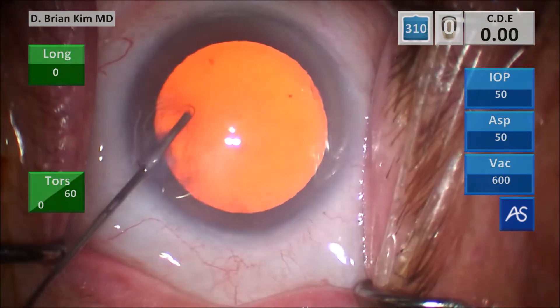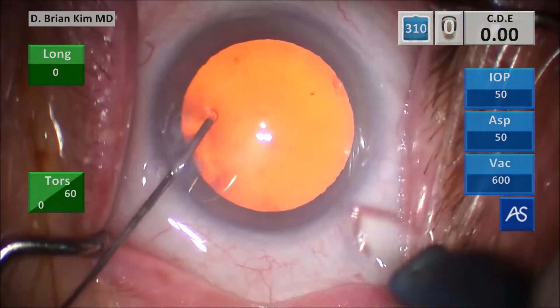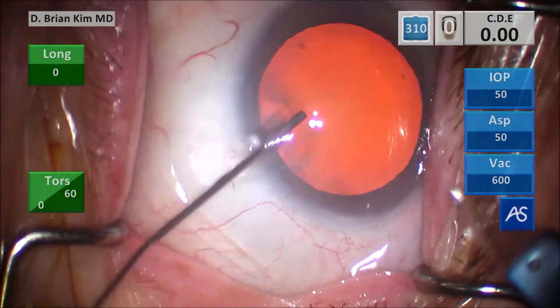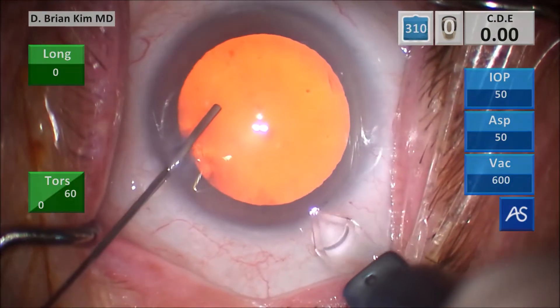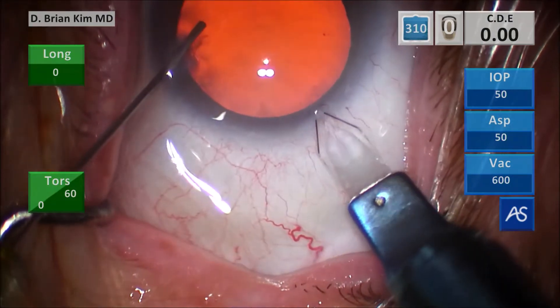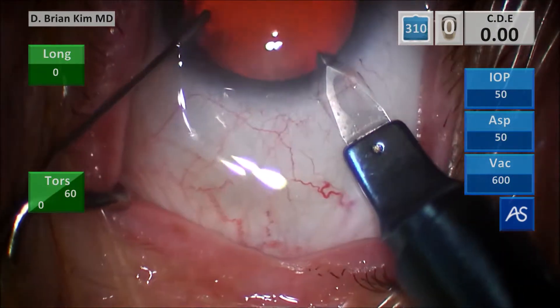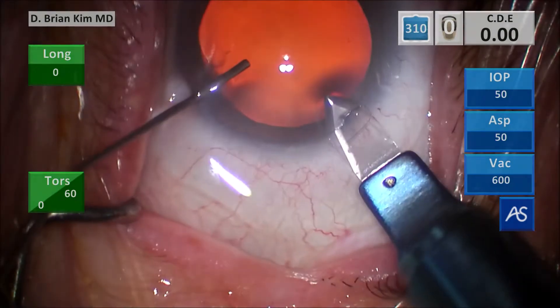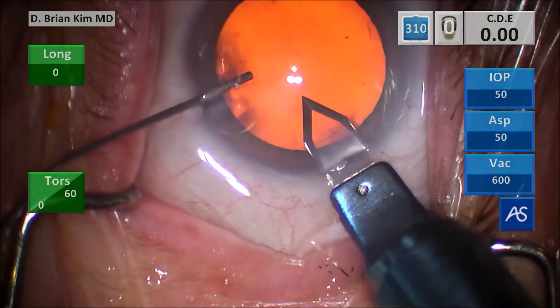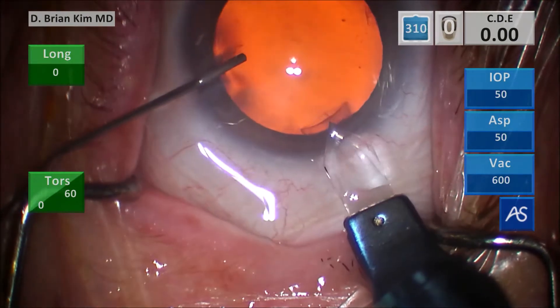I'm doing the Orlok technique as I'm turning the cannula, rotating it so that it Orloks within the incision, and I'm trying to turn the eye down. I make the triplanar corneal incision — I make a vertical groove, place the blade into the deep part of the groove, try to control the eye with the cannula, and then I enter. Again, I'm working in this deep hole. You can see all this water pooling.